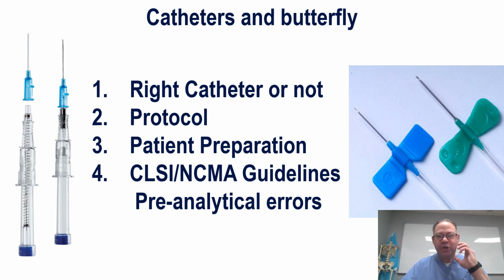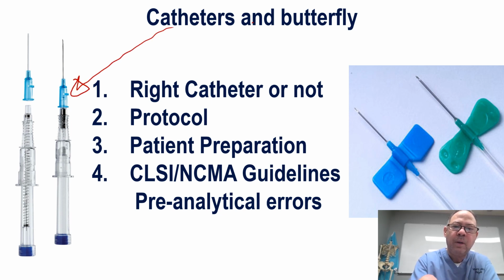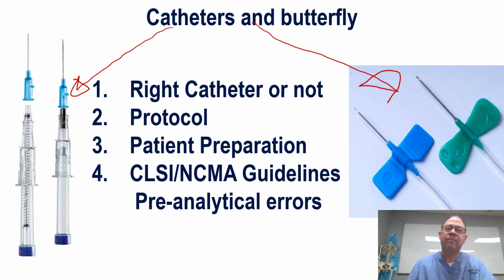So, because they are not working, because the medications are not working, there has to be a problem. So we have to start from the beginning, from my point of view. So these that I'm showing you here are the catheter. This here is the catheter. These here are the butterfly.